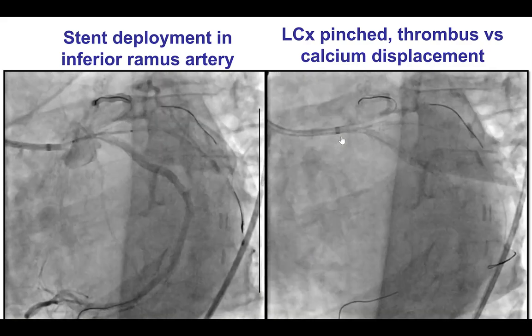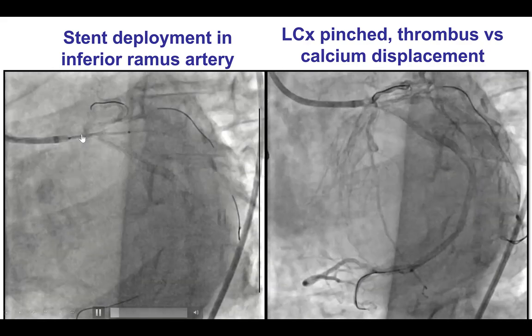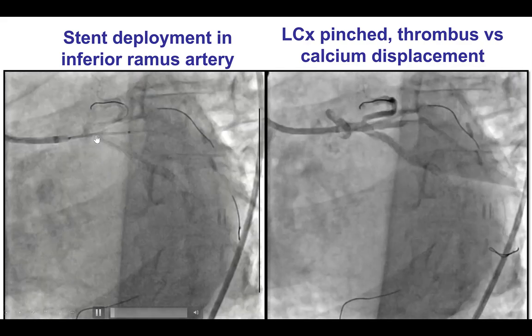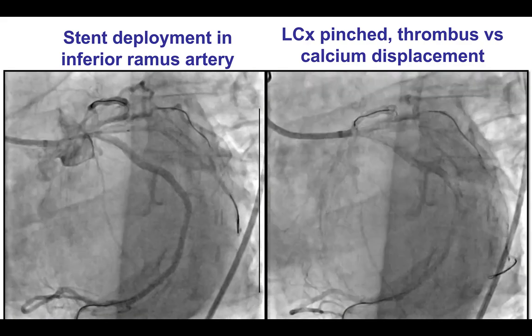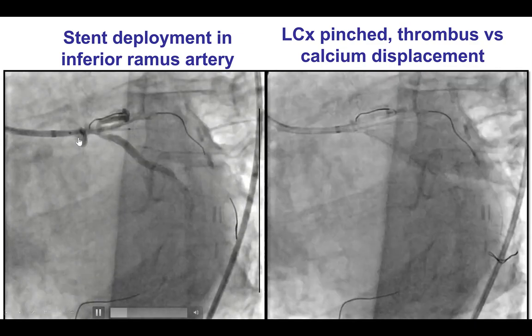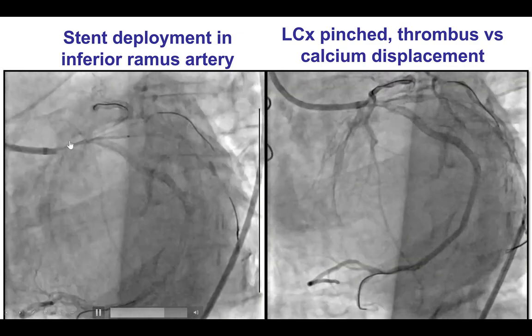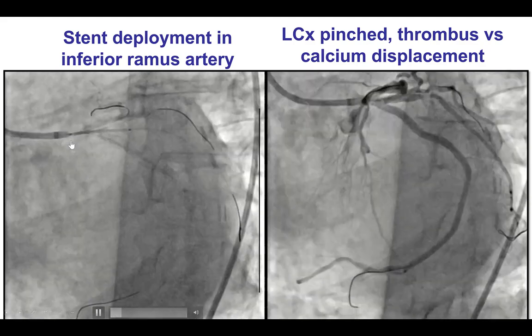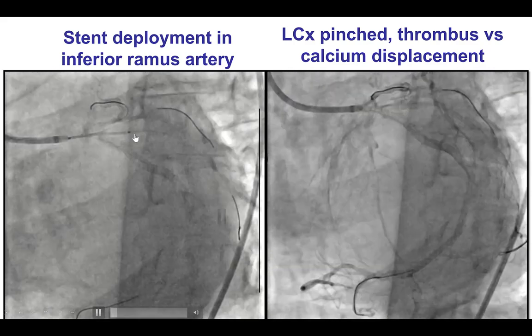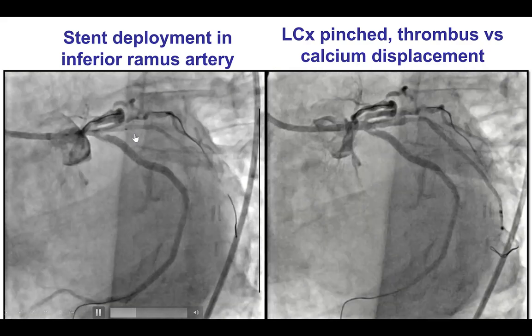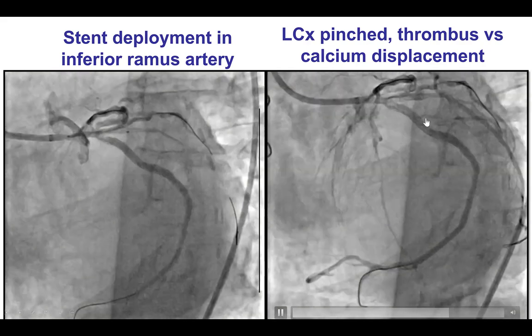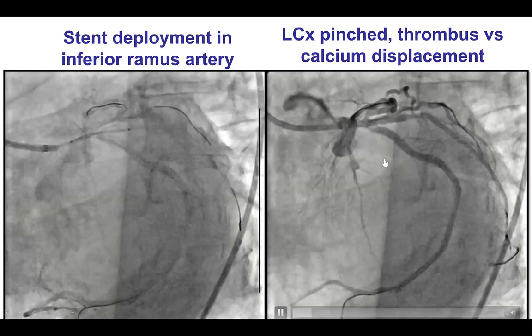The double-kissing crush is a great strategy, but it is time-consuming. Given the hemodynamic issues, it was urgent to obtain good flow in all vessels. Therefore, we changed from DK crush to standard crush. We placed a stent all the way from the ostium of the left main into the inferior Ramus branch, which was deployed and provided good flow into that Ramus branch.